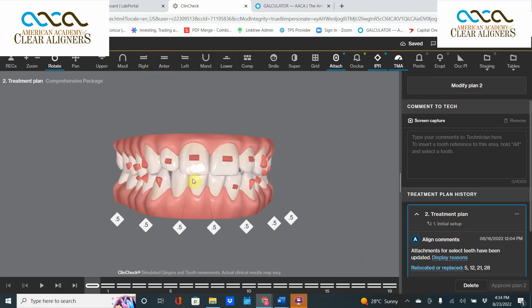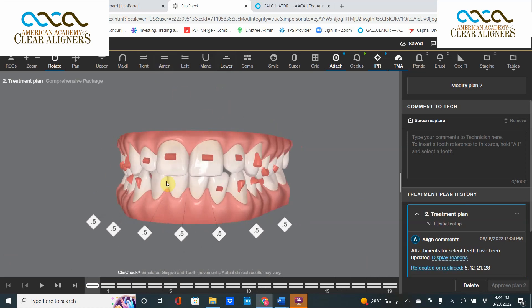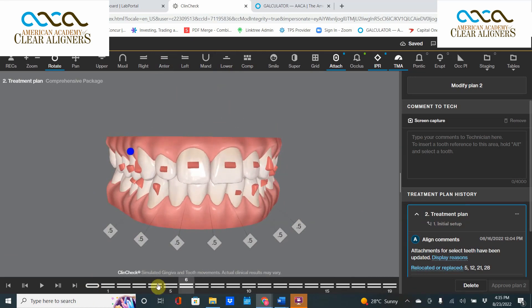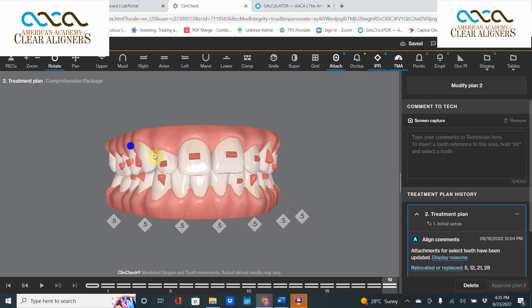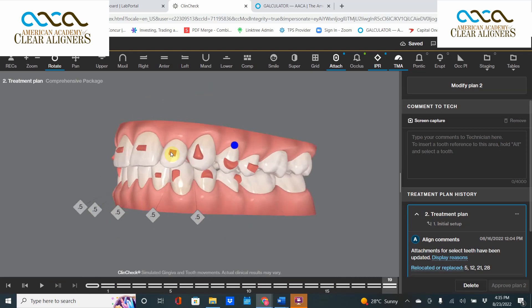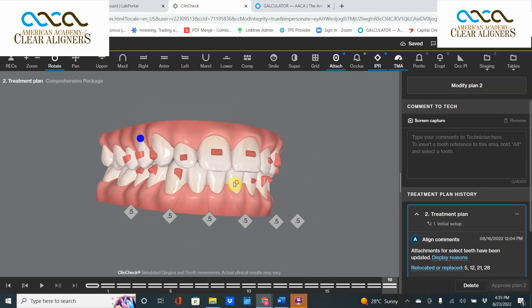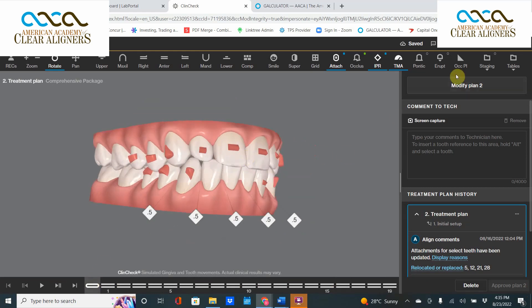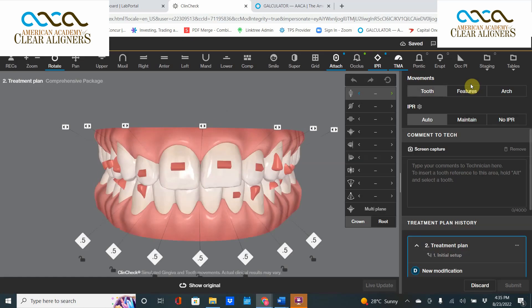So you're thinking: why do I have so much maxillary IPR on this case? The reason is very simple. This is a non-open bite situation, but sometimes despite that, the system is taking the anterior teeth and extruding them all the way down. Look at those anterior teeth coming all the way down — if they come down that dramatically, closing the envelope of function, you wind up needing a lot of IPR to keep everyone straight and within the confines of the upper arch.